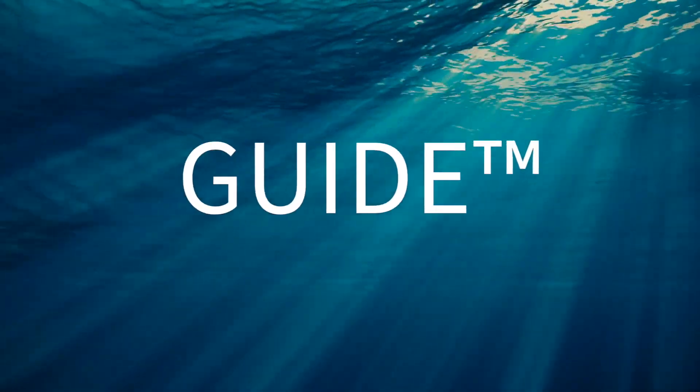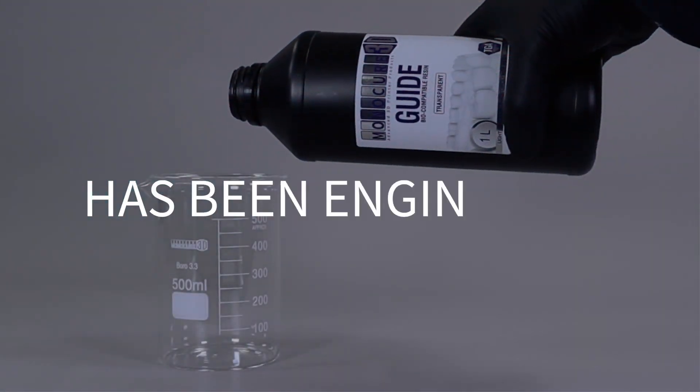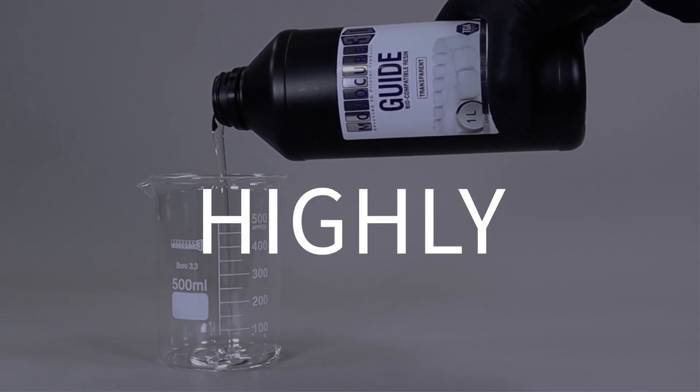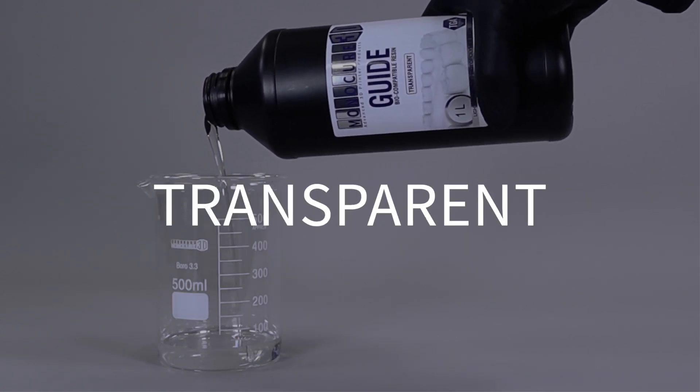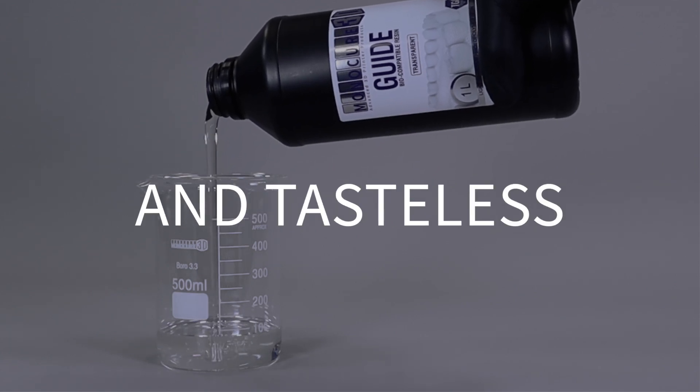Monocure 3D's guide biocompatible resin has been engineered to 3D print highly accurate surgical guides. Once post-cured, this material is transparent, odourless and tasteless.